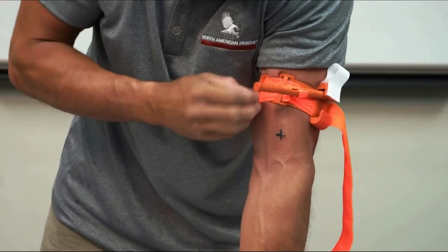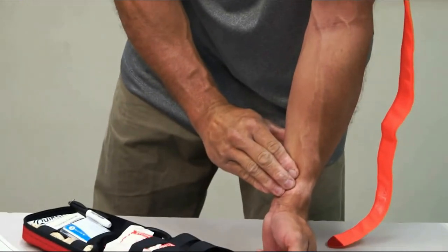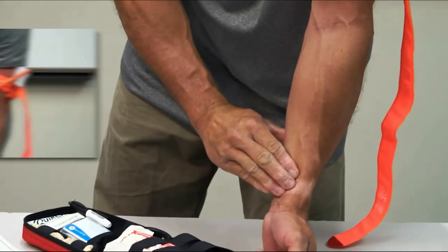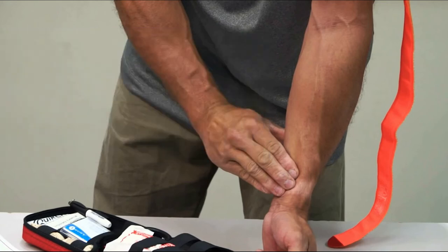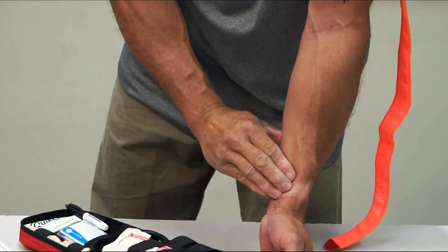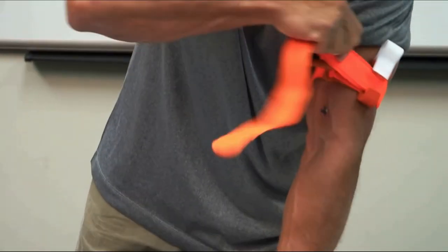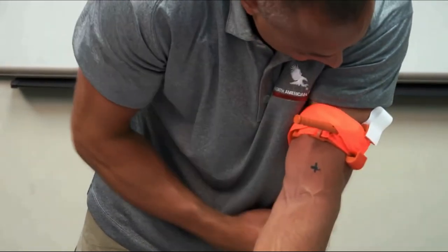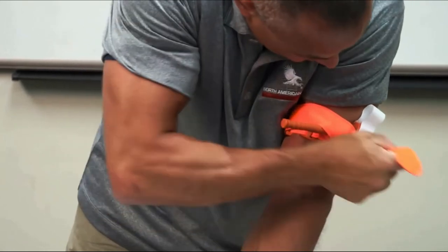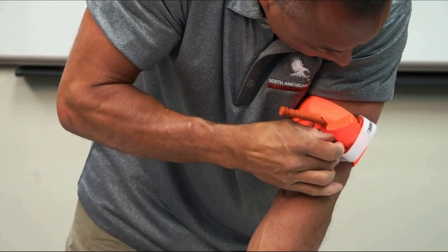Secure the rod inside a clip to lock it in place. Check for bleeding and distal pulse. If bleeding is not controlled or distal pulse is present, consider additional tightening or applying a second CAT above and side-by-side to the first. Re-assess. Route the band between the clips and over the rod. Secure rod and band with time strap.